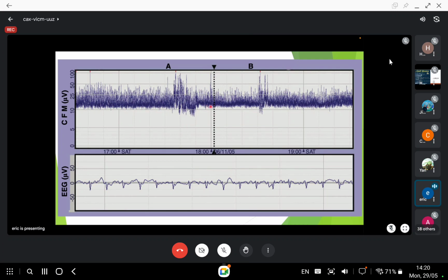Okay, and then here you don't see a capping, but when you look closely, there's a drift of the baseline from here to up here. And this is actually ECG, transmitted waves from the ECG. So how do you know this is from ECG or not? Number one, it will look like an ECG waveform lah. Number two, if this is happening in front of you, you can actually look at your cardiac monitor, and it will correspond to your heartbeat lah. The baby's heartbeat, I mean. Okay, so you can know that this is just an artifact.